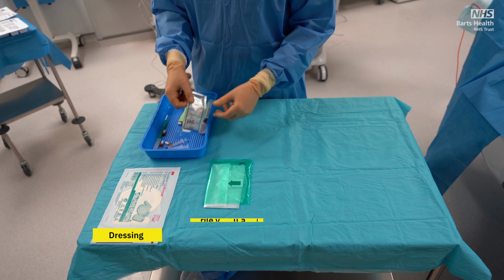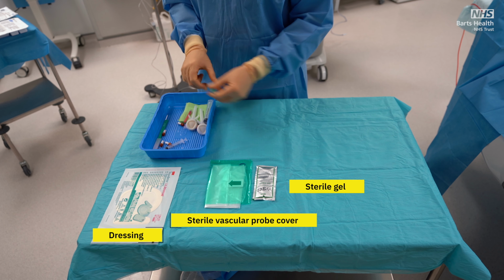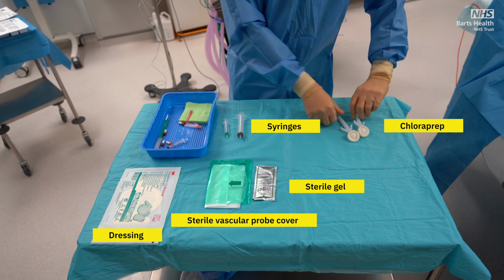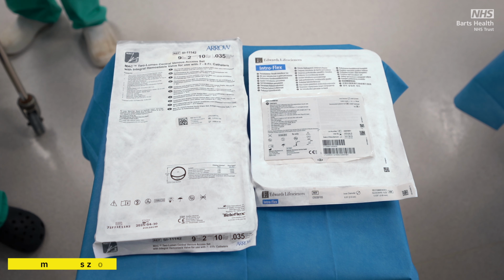So what equipment will you need? Firstly, equipment to place a central venous catheter. An appropriate introducer sheath with a minimum size of 8.5 French, such as a trauma line or Edwards Intraflex.